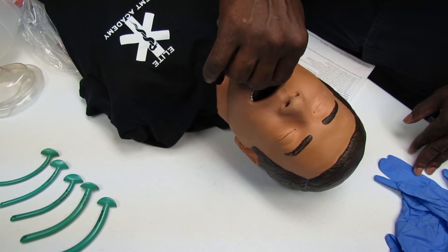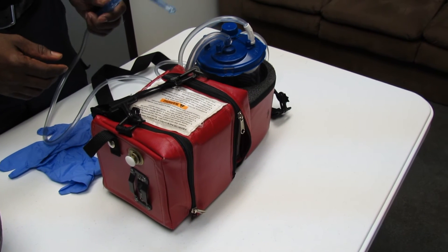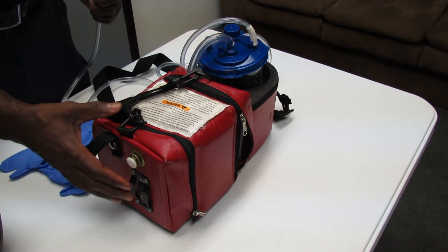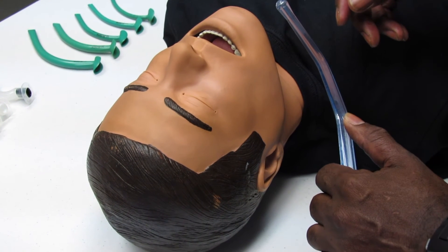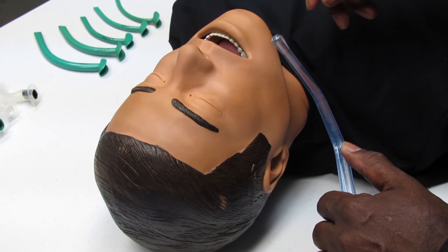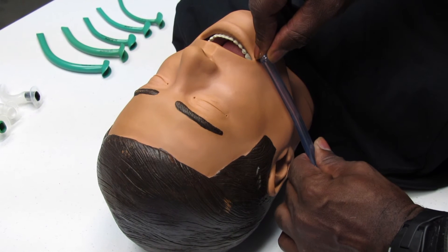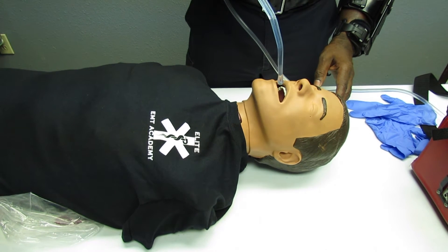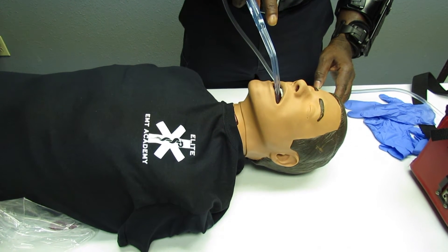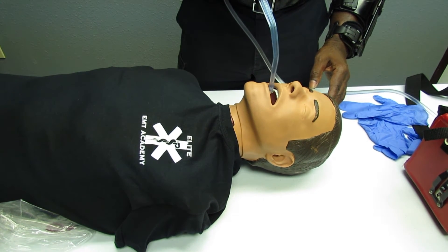Open the airway with a jaw-thrust motion. Prepare your rigid catheter and turn your suction canister on to make sure it's functioning properly. Measure your rigid catheter from the corner of the mouth to the tip of the earlobe to determine insertion depth, placing two fingers there as a depth guide. Insert the rigid catheter into the side of the mouth without suctioning, then press your finger over the hole to create suction and suction on the way out, moving side to side for no more than 15 seconds.